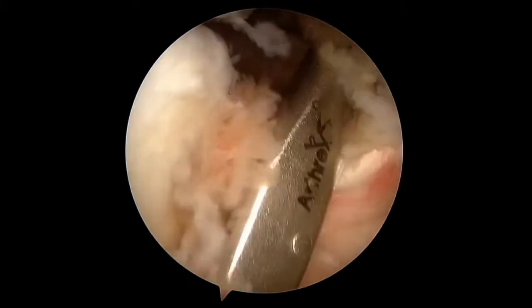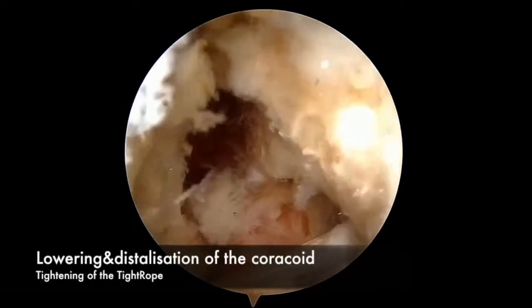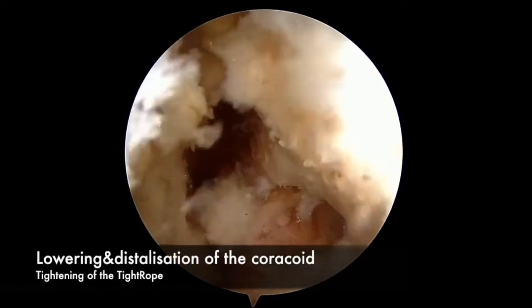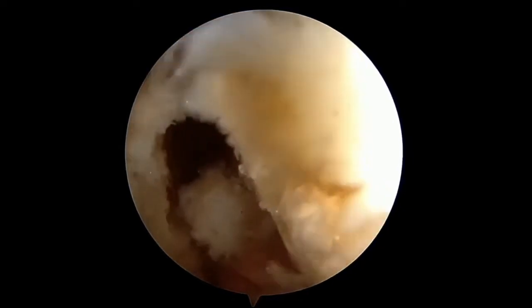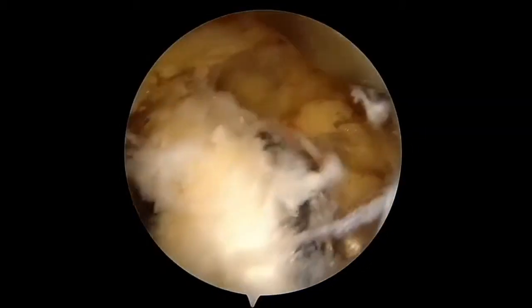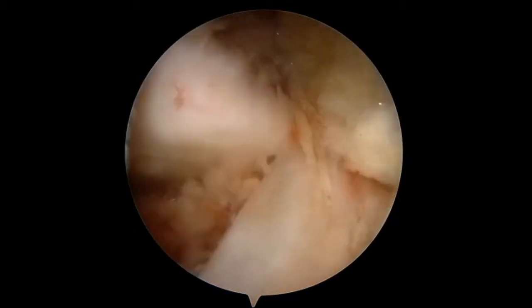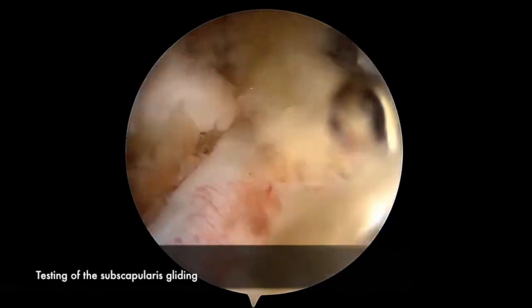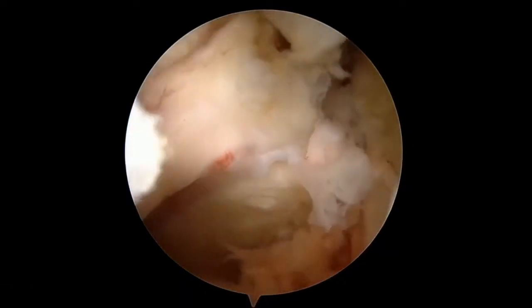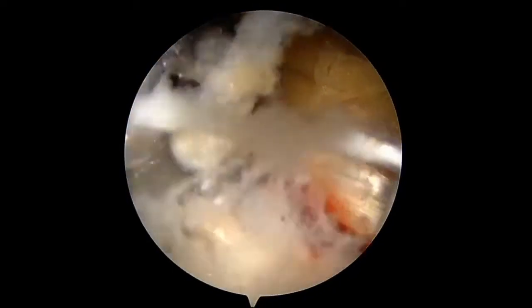An impactor is then placed superficially on the coracoid and the coracoid is gently tapped inferomedially. Simultaneously, an assistant tightens the sutures posterior to the glenoid, pulling the coracoid inferiorly and medially. Care must be taken to avoid completing the coracoid osteotomy and causing a fracture. The tip of the coracoid should not impact the anterior glenoid neck nor the subscapularis. It is important to leave enough space for the subscapularis to mobilize underneath the coracoid. Once in the reduced position, the cortical button is secured in place.